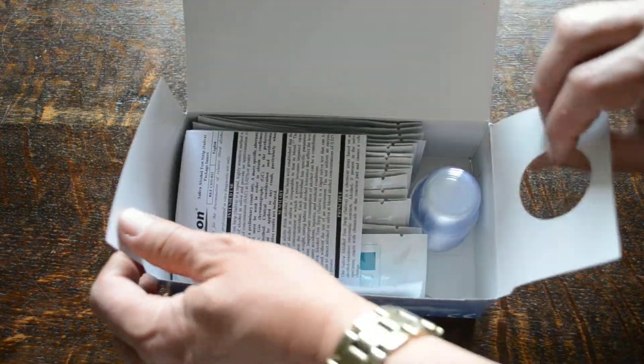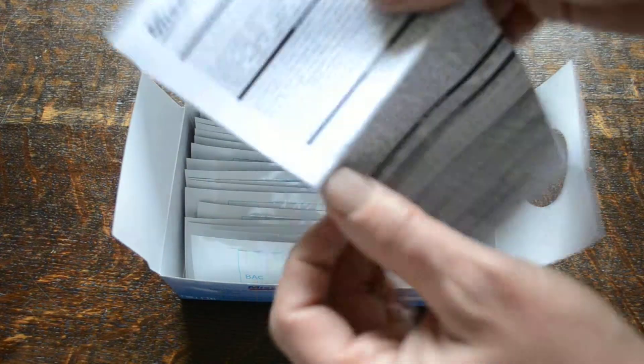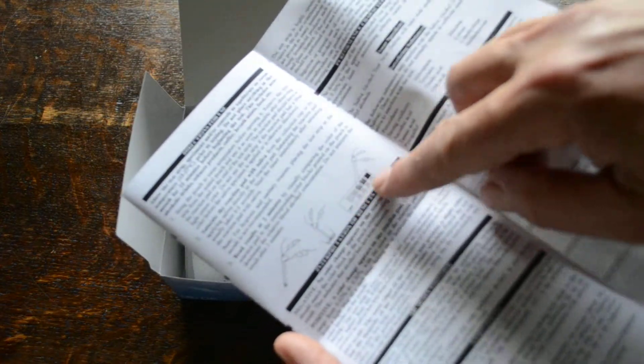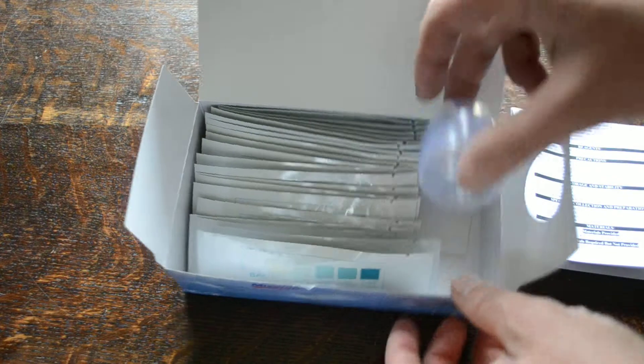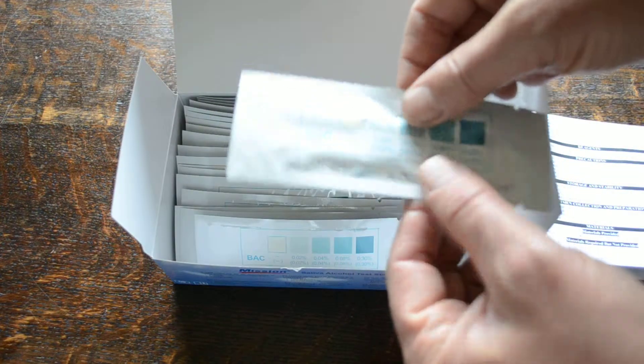When you open this up, you get the Mission data sheet, which gives you the full instructions for use in terms of how to interpret the results and reading the color change on the pad compared to the color change on the foils. There are also 25 little collection pots for saliva, but these aren't absolutely necessary — it's quite okay to just put the strips directly onto the saliva.